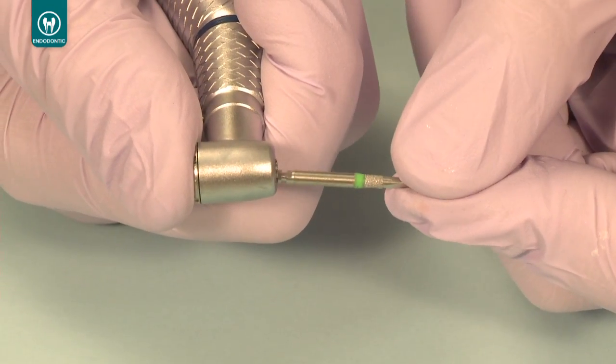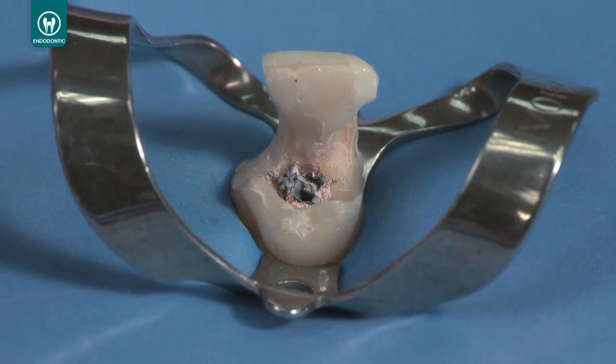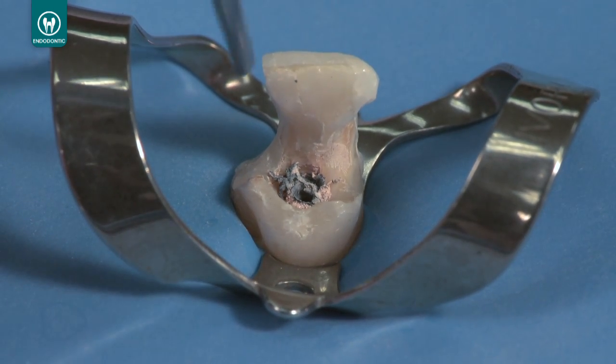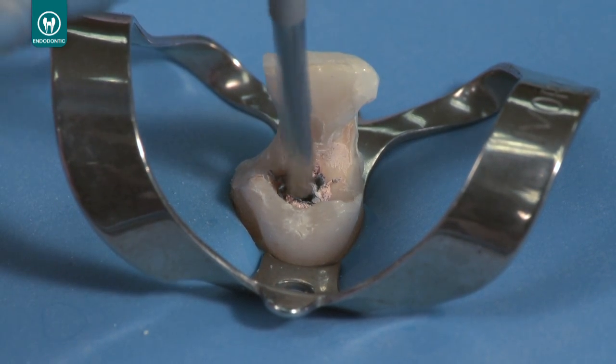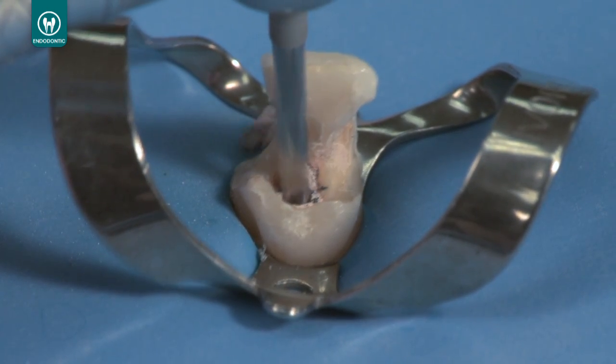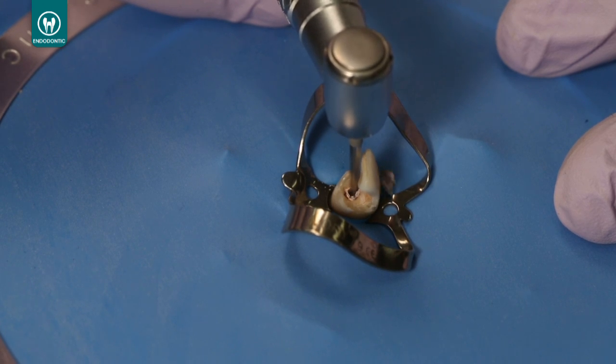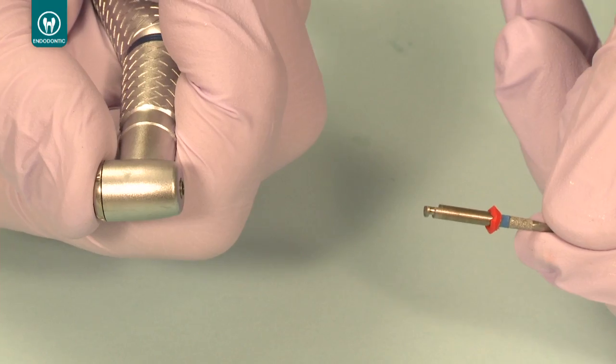When working with rigid carriers, always start with the largest Unicore drill that will enter the filled canal without engaging any peripheral dentin. Place the drill in the center of the rigid carrier and run the drill at 20,000 RPM. After a few seconds, the heat generating tip will begin to melt the carrier. Proceed down the canal until you feel the drill engage the dentin sidewalls, then immediately remove the drill from the canal while still running at a high RPM.